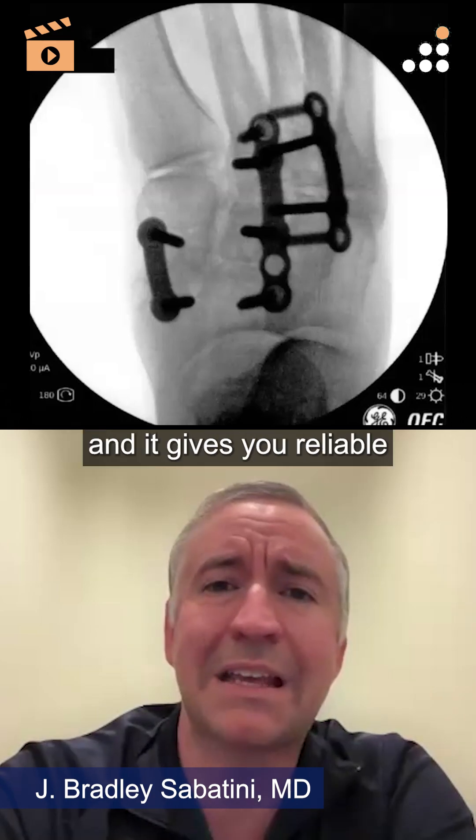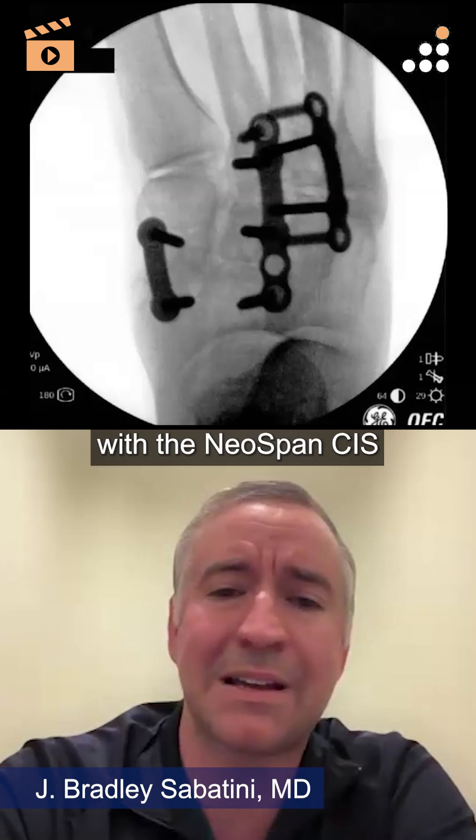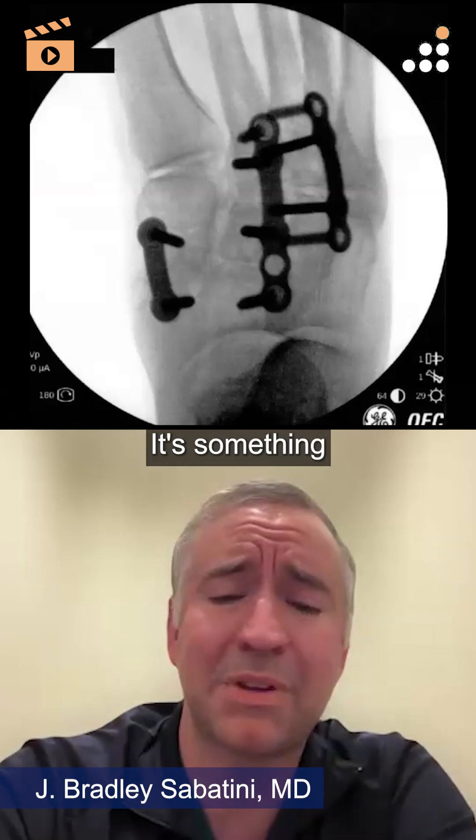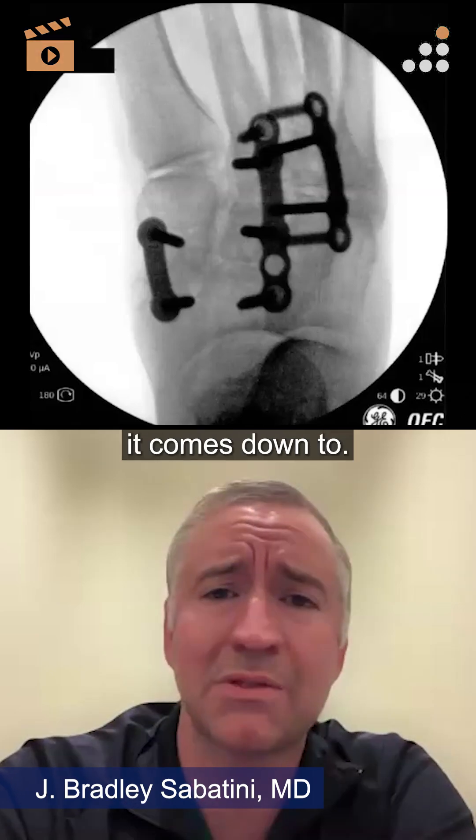At the end of the day, you want an implant that's quick and easy and gives you reliable and reproducible results, and that is what I found with the Neospan CIS system. It's something that I love because it just works — that's really what it comes down to.